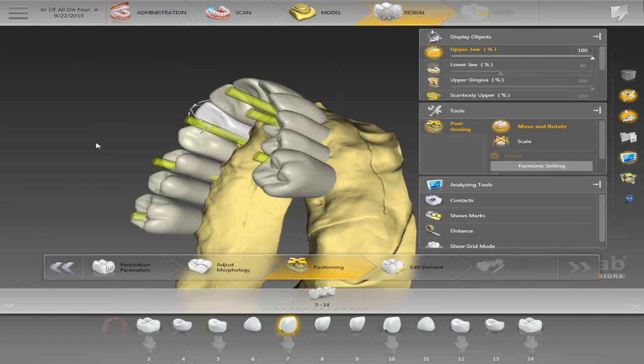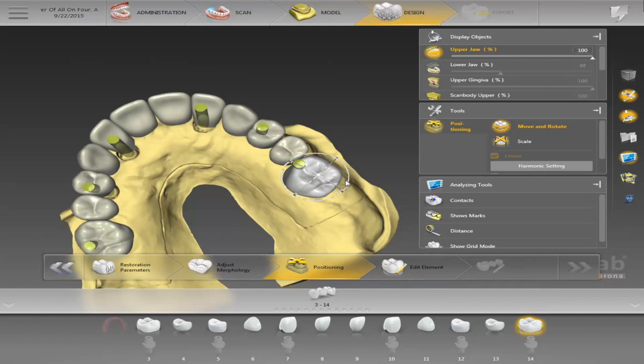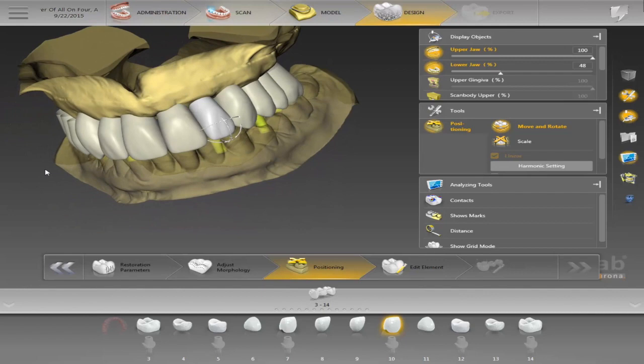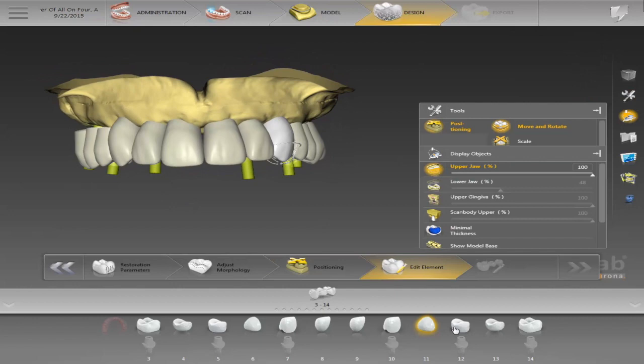I'll make a couple more movements and then we'll propose. Sometimes it takes a little bit long to propose depending on the case, sometimes it doesn't. I'm actually running this on my Apple with Boot Camp so I can design in Windows — that's why it sometimes sounds like an airplane because the computer fan gets going. Now we'll start proposing — you can hear the computer warming up in the background.